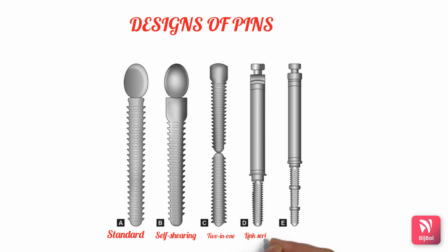The link series design has the pins with a plastic sleeve that fits into the latch type contra-angled handpiece. And these pins also shear off after the pin engages into the dentin, and the plastic sleeve can be discarded.